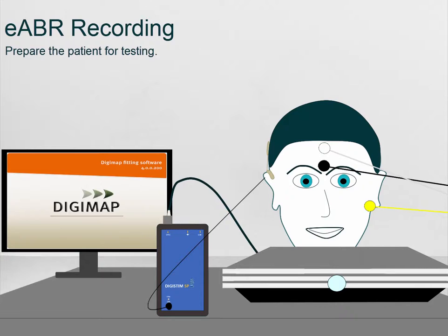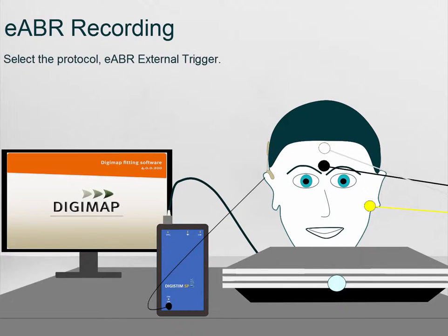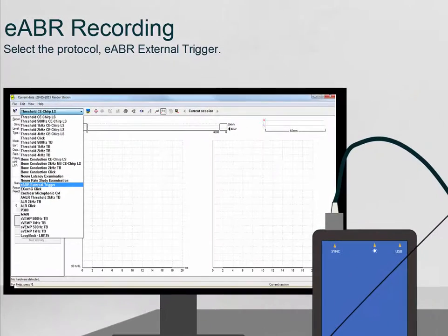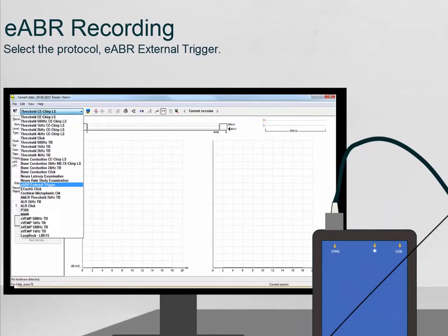In the Eclipse EP software, select the protocol eABR external trigger from the drop-down menu on the test screen.